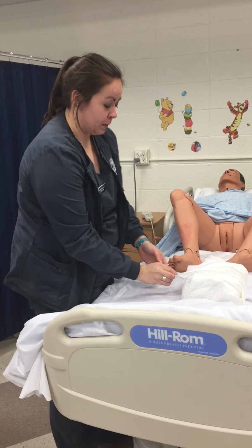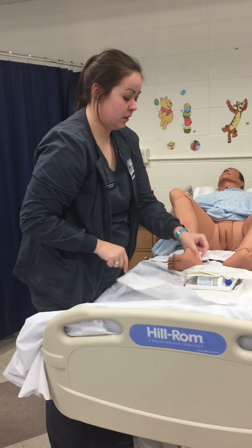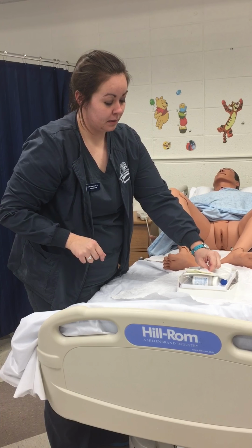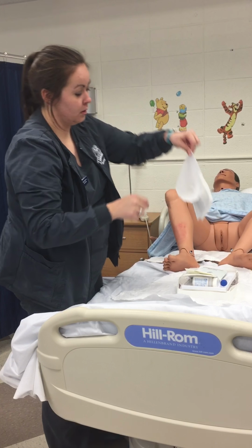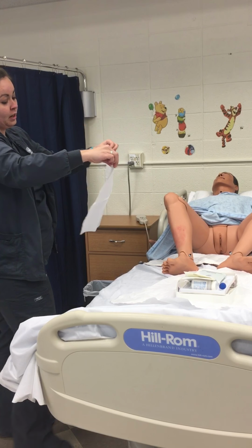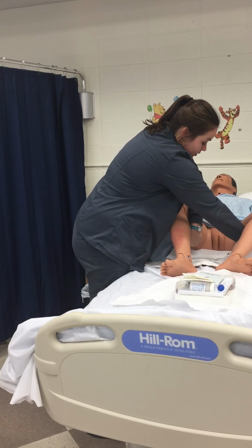So first I would open my Foley kit, away from me first. I would take my sterile drape, and with the shiny side down, I would place that under my patient.